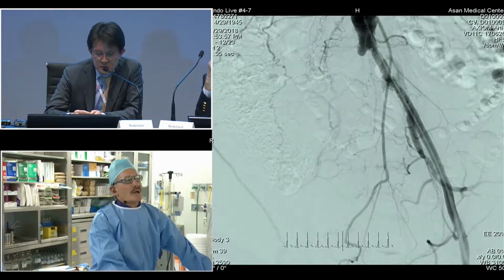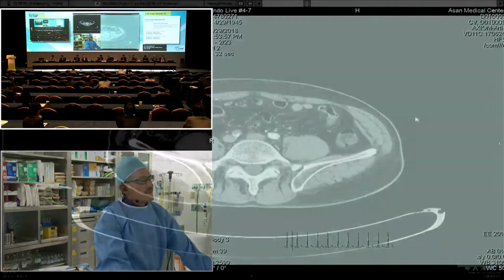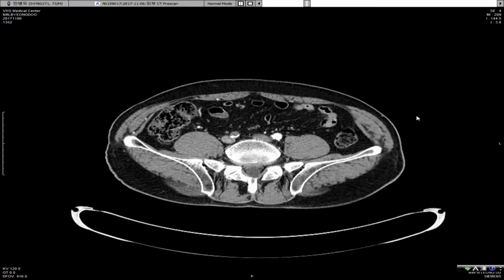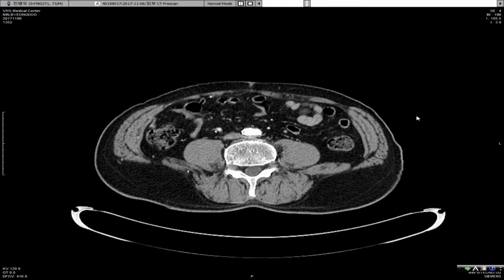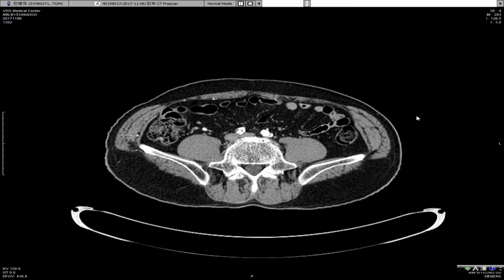Yes. Well, it's occluded, so it's difficult to say, but as you can see, there's heavy calcification and then it's all gray, so it's difficult to say how much of that is plaque versus thrombus, but it's clearly occluded from the proximal stump to the point of reconstitution, and how much of that is plaque, I can't say, but there is a lot of calcium. It's very heavily calcified. Dr. Ida, your treatment strategy?